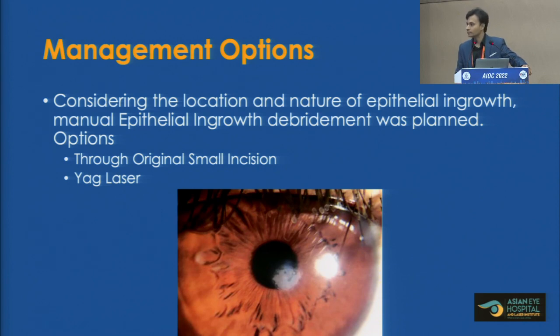Harshul, another reason is if you have any bleed, suppose you have a vascularized cornea and the flap edge has some heme. That lifts the edge of the flap, and through that epithelium can grow in. Absolutely. So basically you have to make sure there is nothing between the flap edge and the bed. So what do you do when you are cutting the flap with a keratome and you have a bleed in a vascularized cornea, and some stains remain even at the end of repositioning the flap?